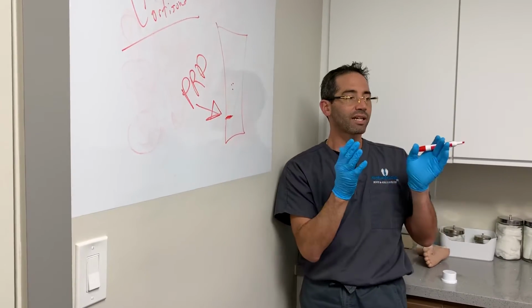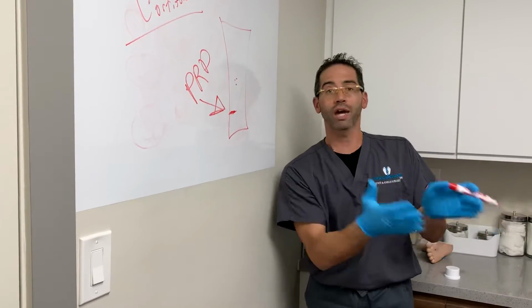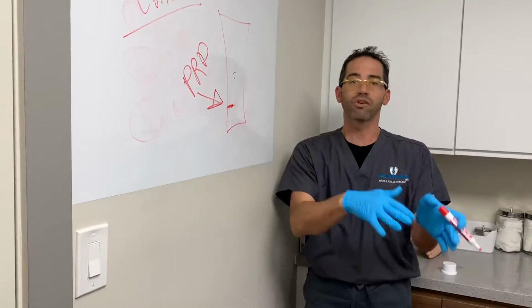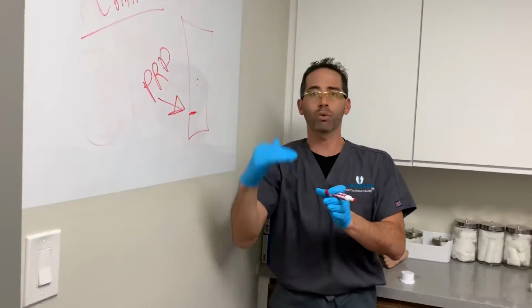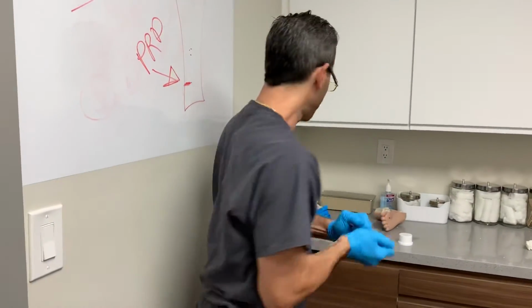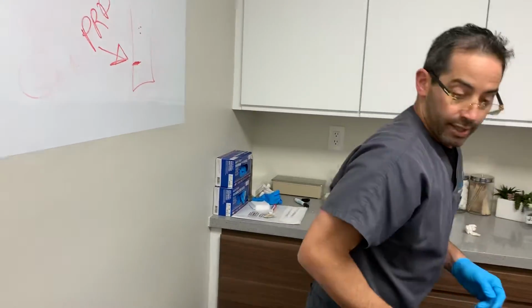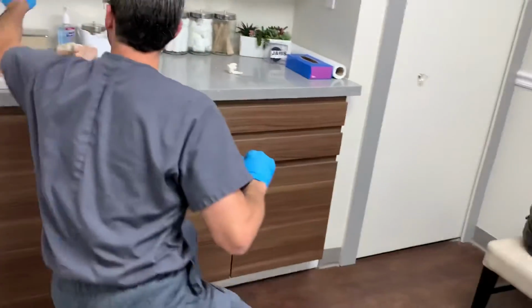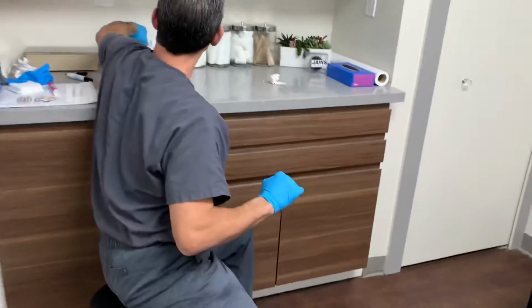Because I do agree with her. I don't want the patient or any patient looking back and saying I should have tried this before this, or we're just following the algorithm. So without further ado, we're gonna perform these injections under ultrasound guidance, right? I always like to use the ultrasound.